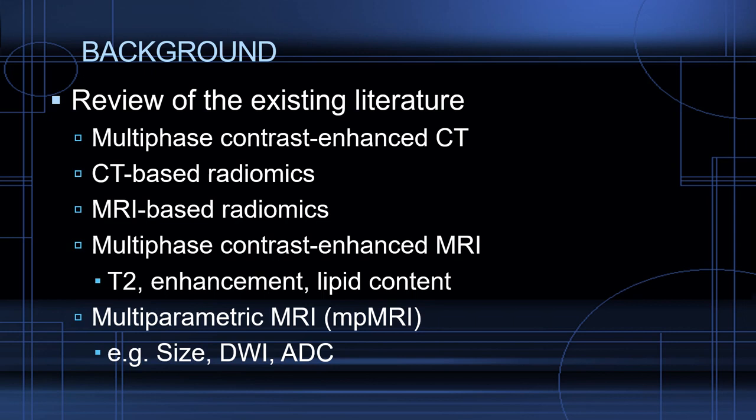Presently, multiple imaging modalities are available for the investigation of clear cell RCC, some of which are listed here. In particular, multi-phase contrast-enhanced CT and MRI have been used to identify and classify solid renal lesions, including RCC. In my presentation, I will be addressing multiparametric MRI.